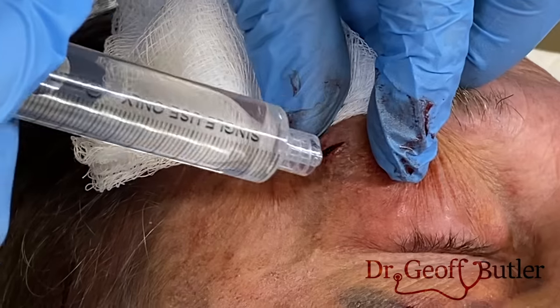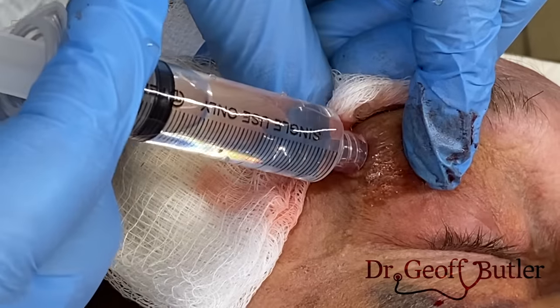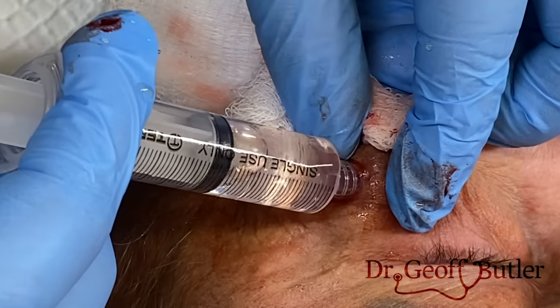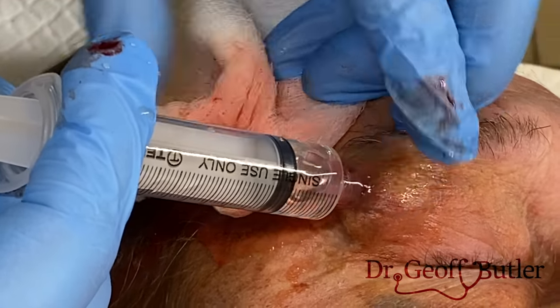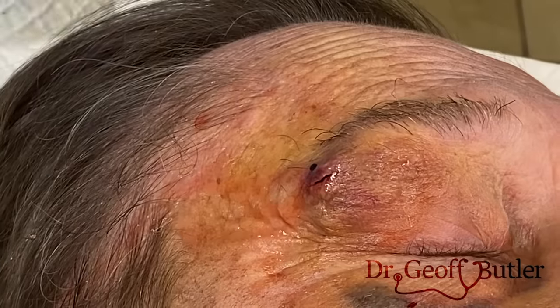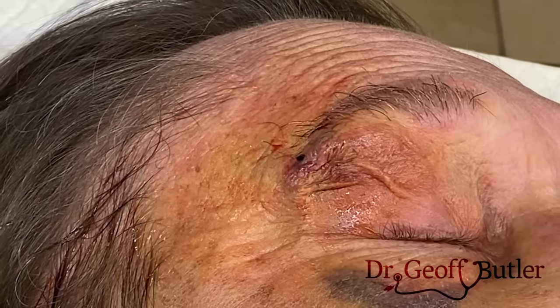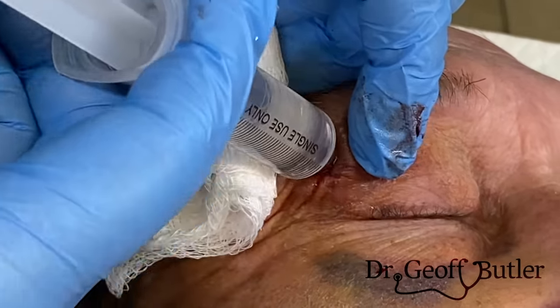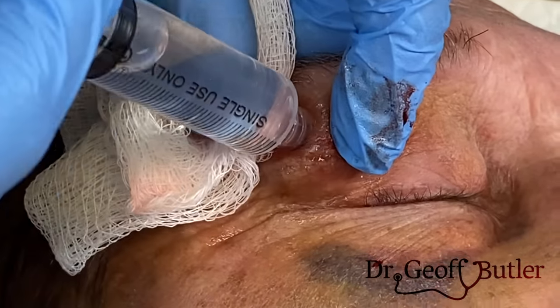Now I want to irrigate this — in part to clean it, but also to see if we can dislodge more clot material. So I'm going to re-inflate it. Here I try to change the angle just a little bit, only because I'm trying to disrupt clot from various walls — it's a three-dimensional structure.